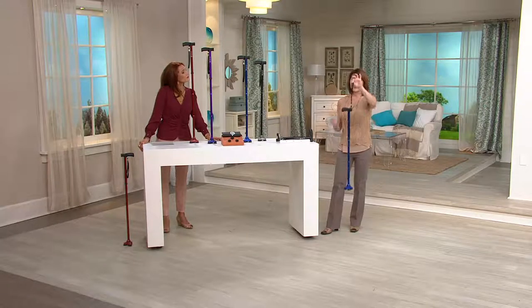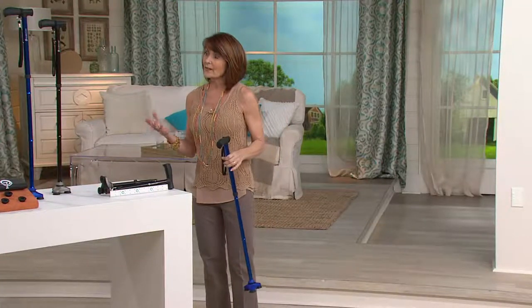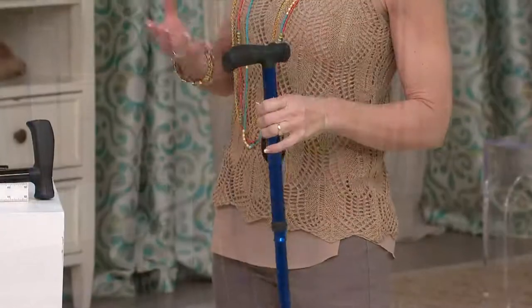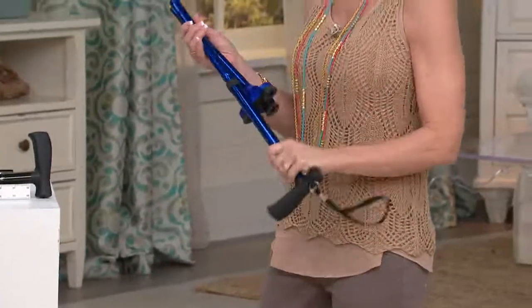The wrist strap works with you too — you can hold it like that. You're bringing confidence, stability, independence, dignity, and freedom to people who otherwise might stay home. A little fashion sense too — I love the colors. So many times if you're using a cane, it's not because your mind is old.